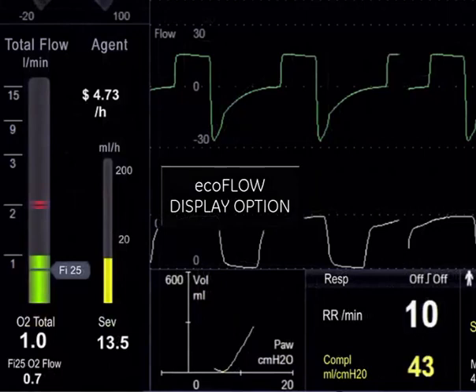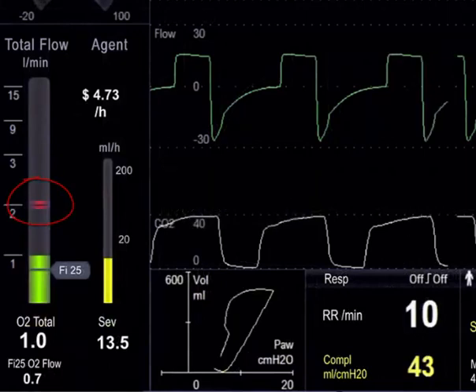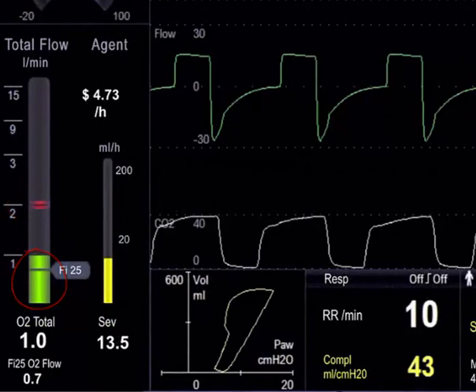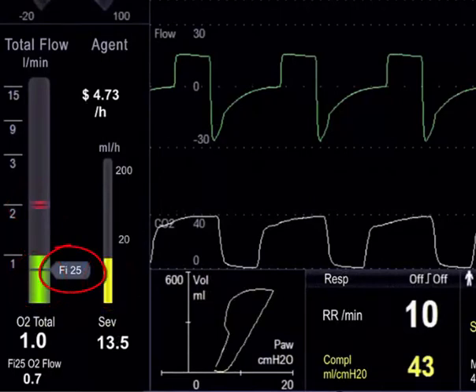The ECOFLOW display option replaces the traditional flow tube display on screen with a display that shows total fresh gas flow, oxygen flow, and anesthetic agent consumption alongside the clinician's pre-set oxygen target.